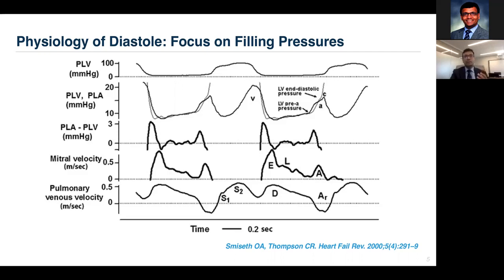During the diastasis, the pressure gradient again equilibrates. And as a consequence, the flow across the mitral valve is reduced. And this is the diastasis phase where typically you do not see much flow velocity. Infrequently, this flow velocity could be higher if the pressures are still not completely equilibrated, and this can give rise to the genesis of an L wave. And this L wave signifies elevated mean left atrial pressure, even in the phase of diastasis.